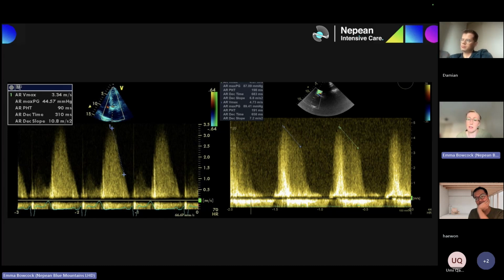need to interrogate that aortic valve, moving to TOE is important, and is an option for you to try and quantitate better. And often you get nice alignment either in your deep transgastric or in your transgastric at the sort of 120, where you get that, Sam says, the second bite of the cherry with interrogating the aortic valve.